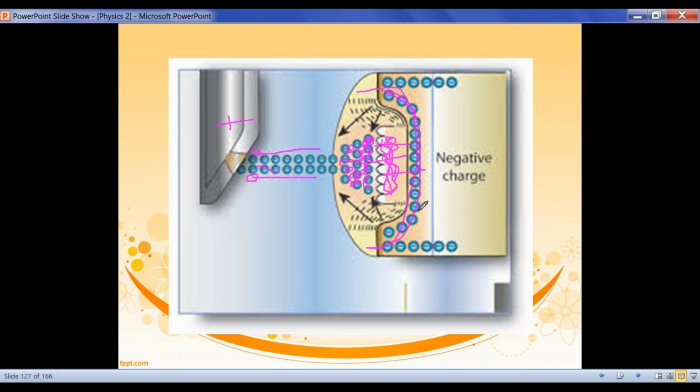Okay? So, again, dahil sa sobrang dami ng electrons na naka-standby sa harap ng ating filament, yung mga succeeding electrons ay hindi na po makalabas dahil nire-repel po sila ng mga electrons dito. Yan po yung ibig sabihin ng ating space charge effect. Okay? So, ano po yung kanyang implication? Kapag yung ibang electrons ay hindi na nakalabas, kukunti lang po yung amount of electrons na mapupunta sa ating target. Ang sabi natin kanina, pag konti ang electrons, konti rin ang X-rays. Okay, maliwanag po ba?